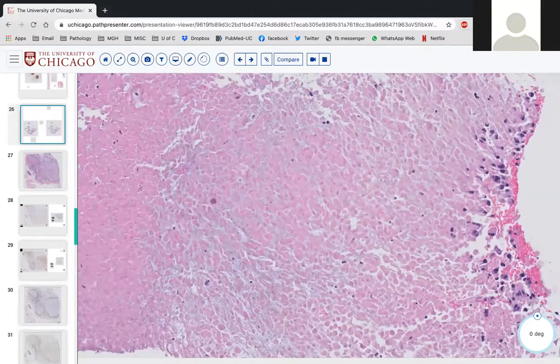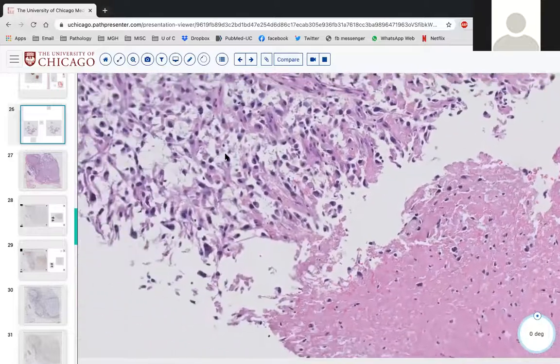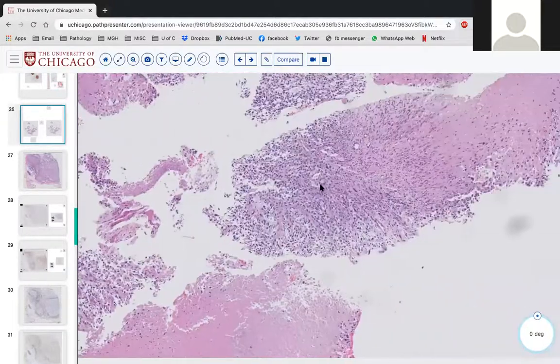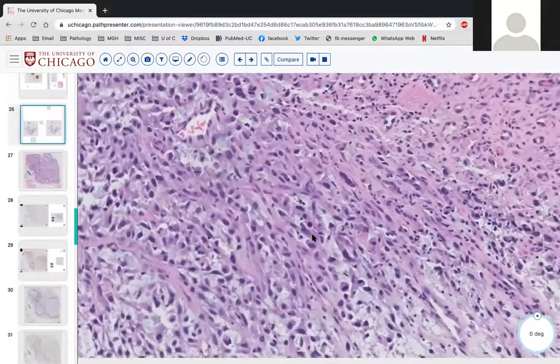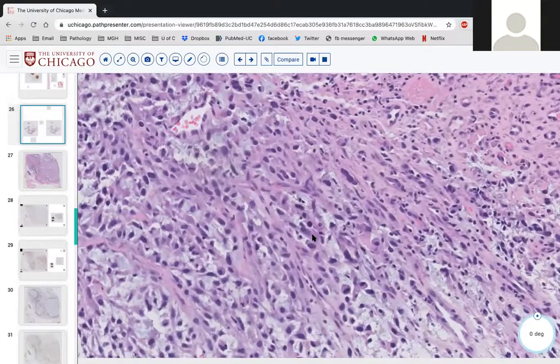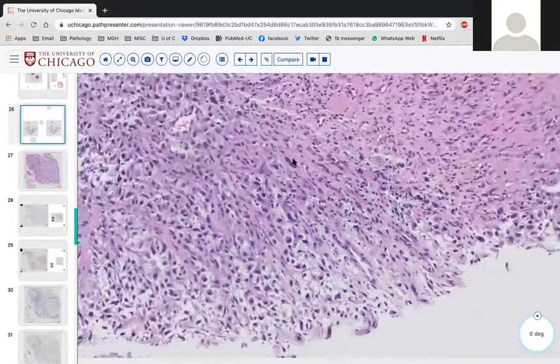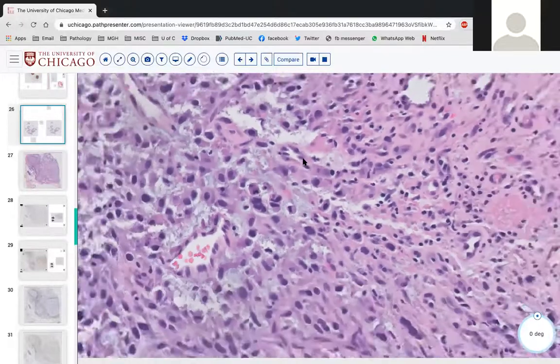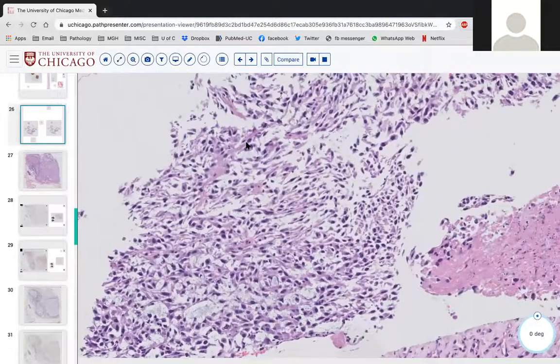I can describe a little bit. Yeah, go for it. So here I think we have this junky, I'm concerned about necrotic material where we were before. And then the tumor proper has these rather pleomorphic looking cells with a number of mitoses and scary looking nuclei, high-ish N to C ratio. Cells look vaguely spindled in some places, but I don't know that I would really hang my head on any of that.